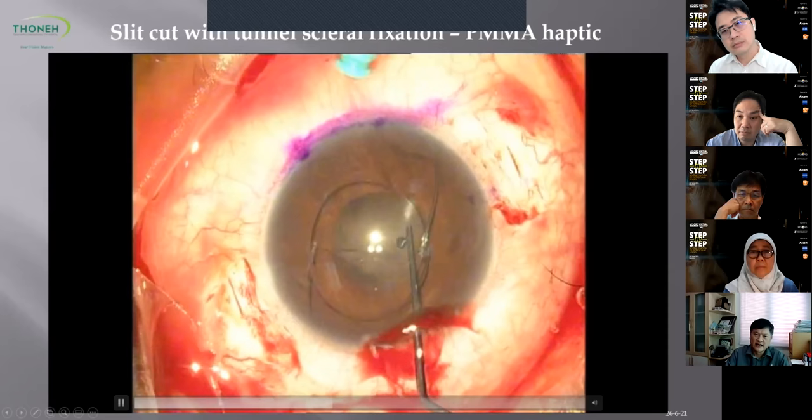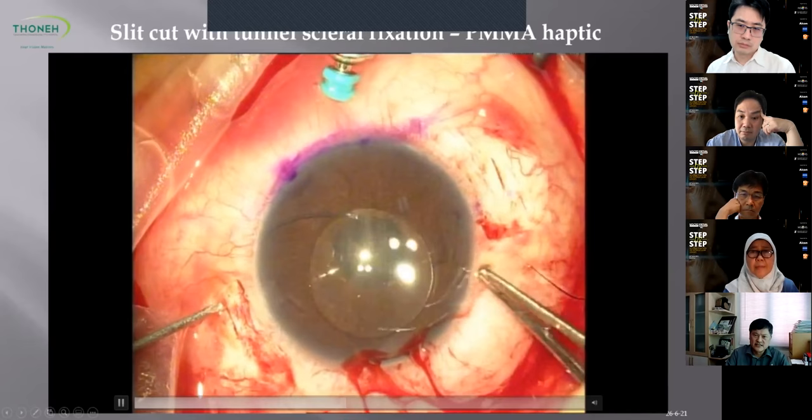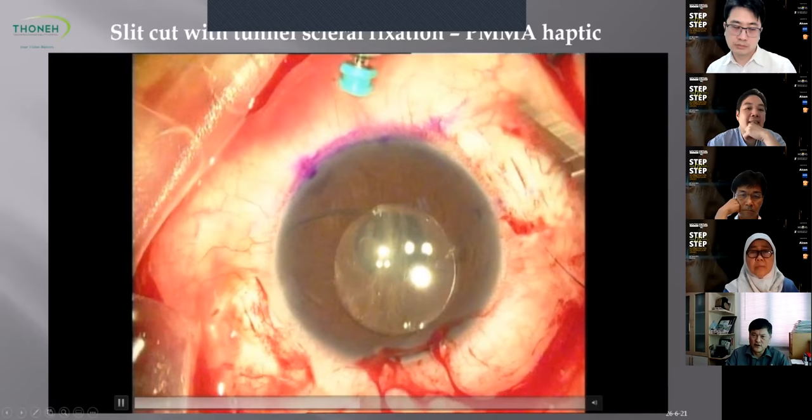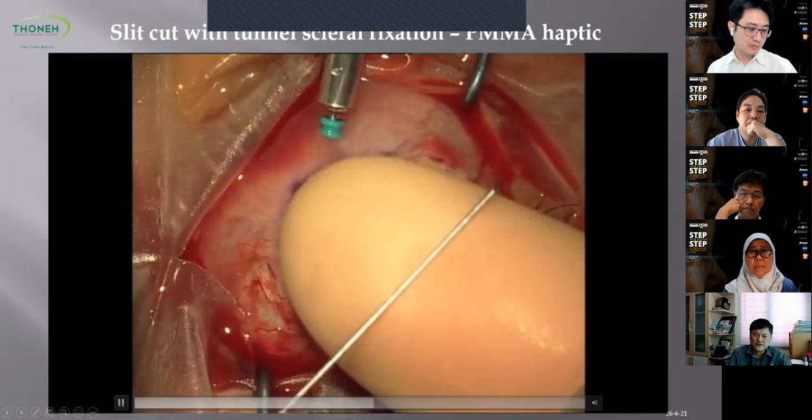Then using a bent 25G needle, I create a sclerotomy. Again, I check the IOP of the eye first. If soft, then I turn on the infusion until it's firm for this kind of maneuver to be performed. Then I bend two serrated tip microforceps. One is a 23G forceps. And then this blue one is a 25G forceps.